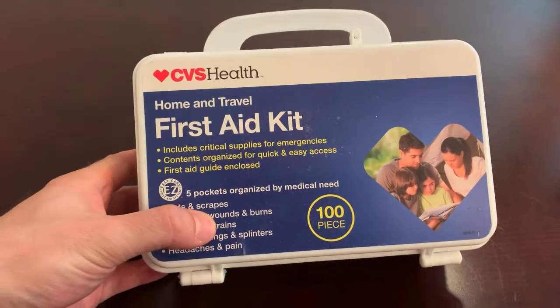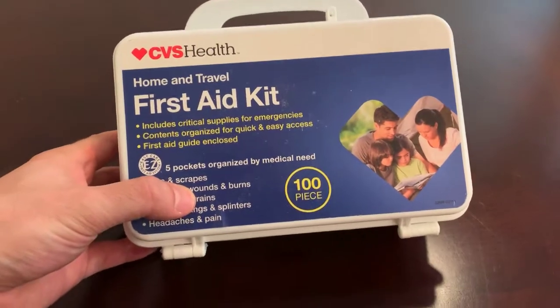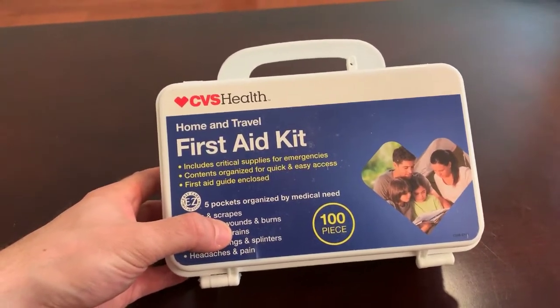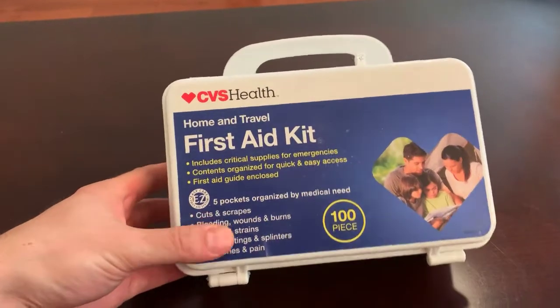Here is the CVS Health Home and Travel First Aid Kit. It's always good to have this on hand — you never know when you might need it.